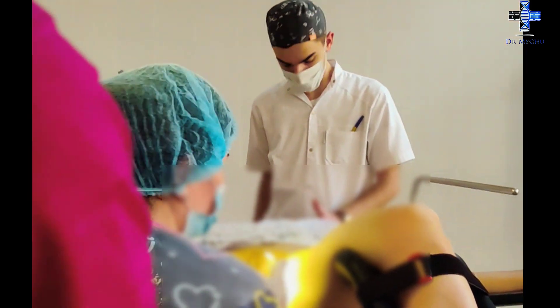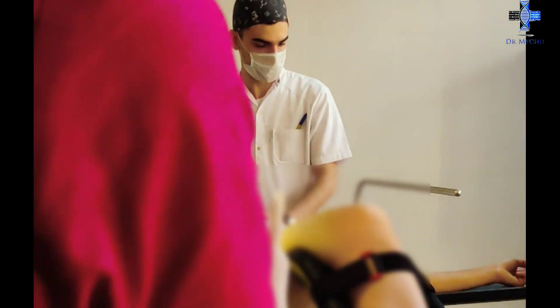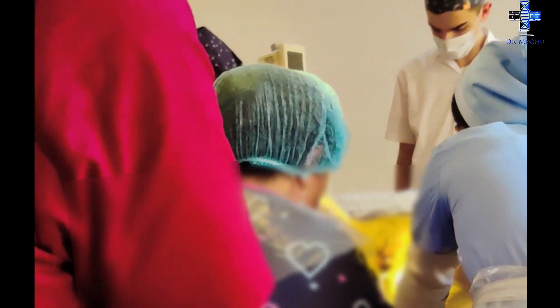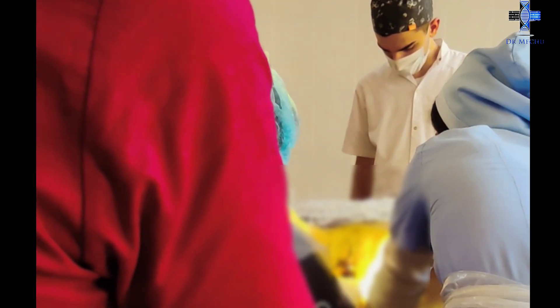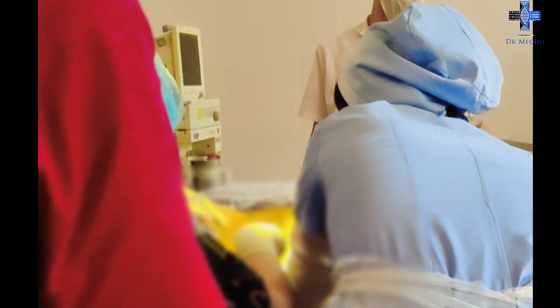If the woman is in a pre-menopausal stage, misoprostol prior to hysteroscopy for cervical dilation appears to facilitate an easier and uncomplicated procedure. Then the hysteroscope with its sheath is inserted transvaginally, guided into the uterine cavity. The cavity is insufflated and inspection is performed, as the uterine cavity is a potential cavity and needs to be distended to allow for inspection.